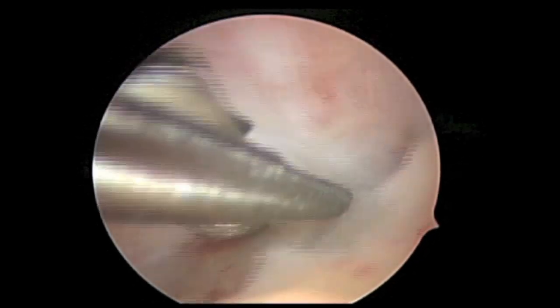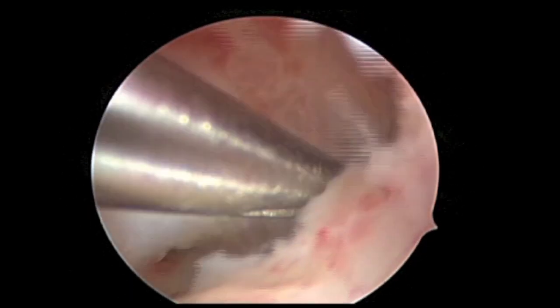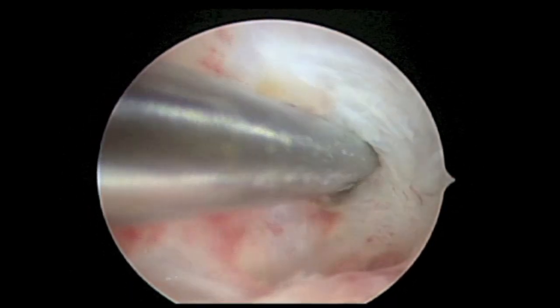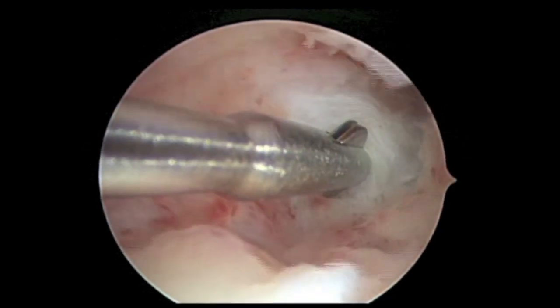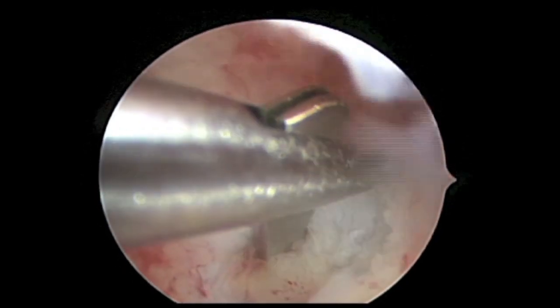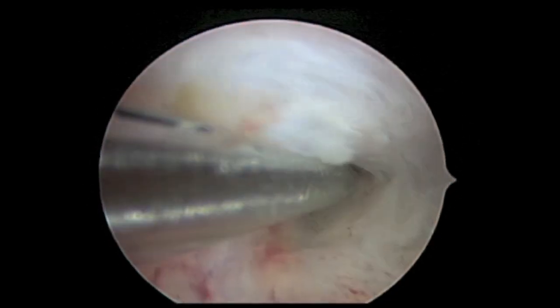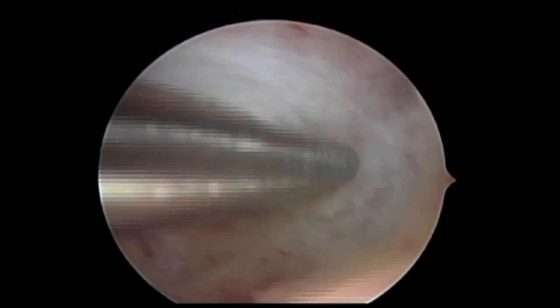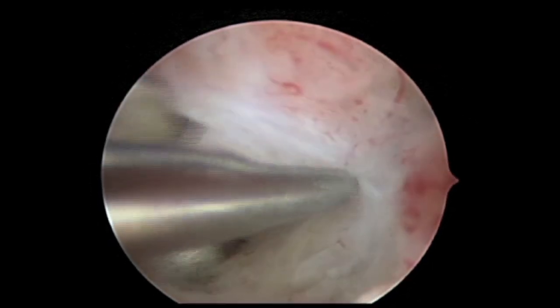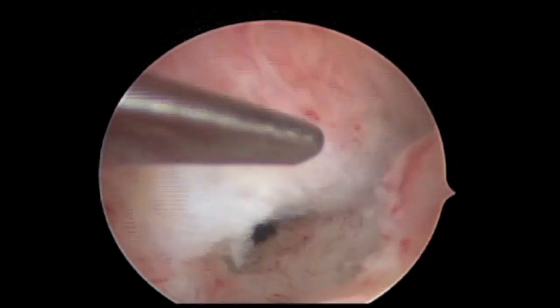Avascularity of the adhesions is a key clue to safety. As the dissection approaches the myometrium layer, we would see increased bleeding. The adhesions are not innervated and therefore patients will tolerate sharp adhesiolysis well. However, the myometrium is innervated and once entered, patients will suddenly experience a sharp increase in pain. These two features are important in mitigating the risk of uterine perforation, and it is imperative to frequently recheck your position in the uterus and reevaluate your progress.